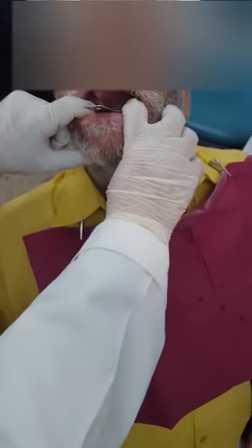Seating has three steps. First, going inside and inserting it in the patient's mouth. Then, raising the tissue and around — taking the lip out and the tongue out so they will not get trapped underneath the impression. And third is the vertical press.